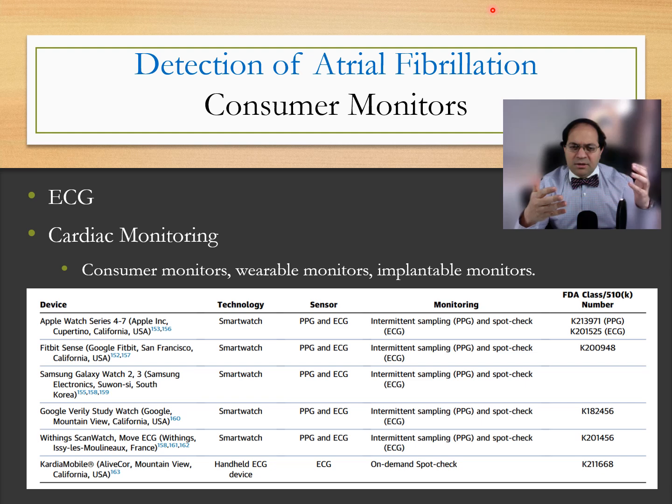We might get better consumer monitors. And as you see here, the Apple Watch uses PPG and EKG both, but the EKG is a spot check, so you basically need the person to check it actively, and it's not going to do the EKG passively or automatically. PPG can be done passively, and it is intermittent, it's not constant. So that's about consumer monitors.